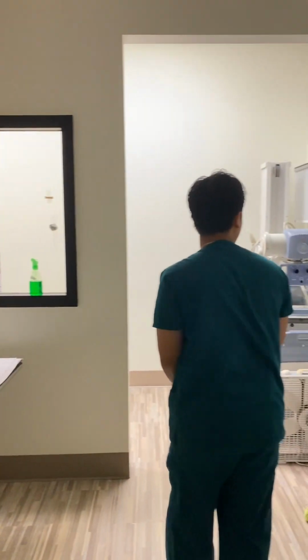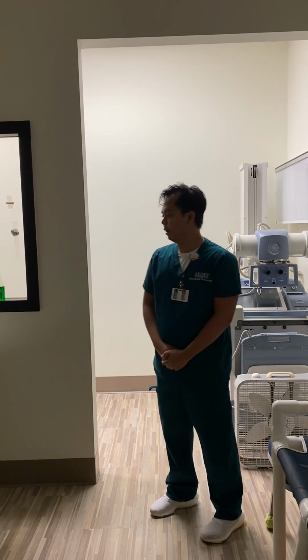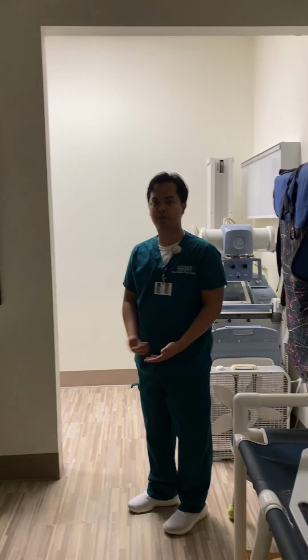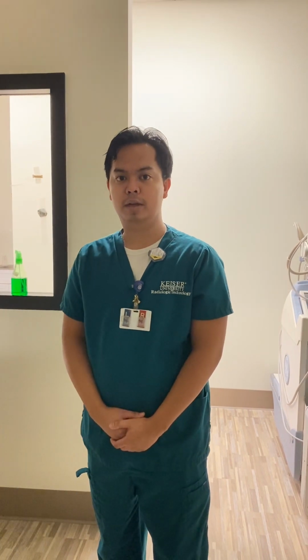Oh, and make sure they have the gown and the shield ready as well, and make sure you have your markers ready, as well as two pens so you can write down the history that you're going to take. So basically we're going to go to the room, get our patient, and introduce ourselves.